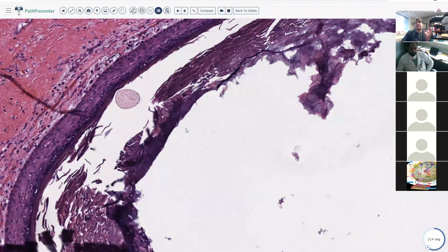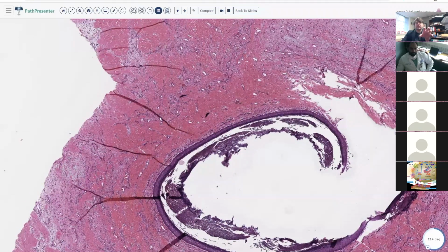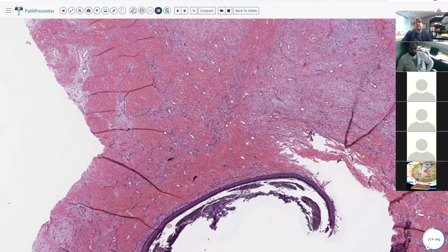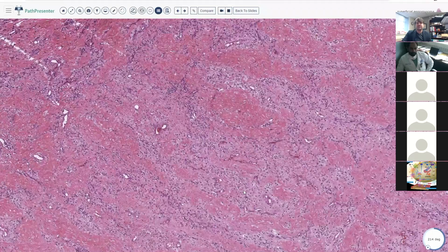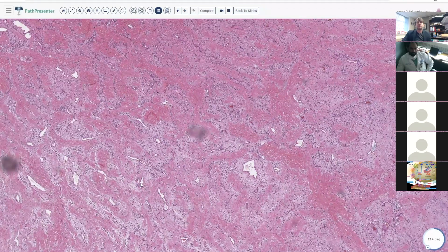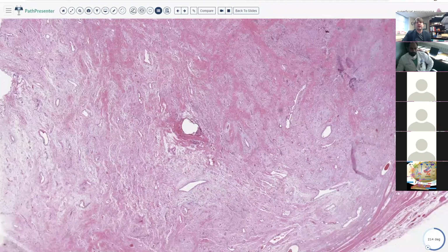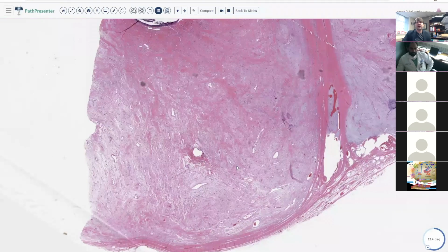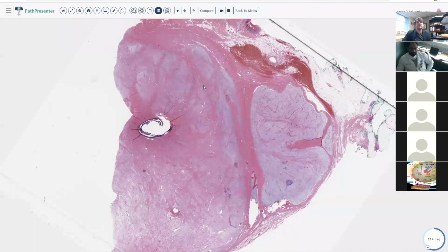So it's basically made a follicular cyst in the middle of this lesion, and probably it's ruptured at some point, which has caused it to get scarred and fibrotic right around the edge of the cyst. But that's a relatively common finding. A significant subset of cutaneous myxomas will have adnexal structures, cystic structures in the midst of them. All right, so nice example again of cutaneous myxoma, AKA superficial angiomyxoma.